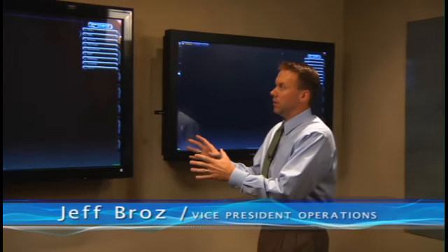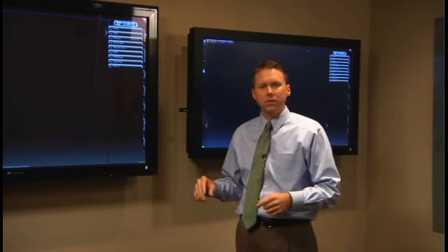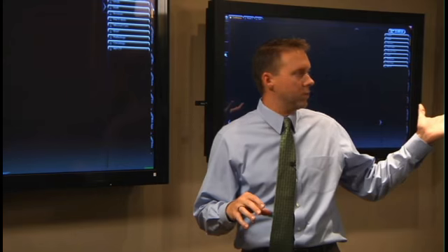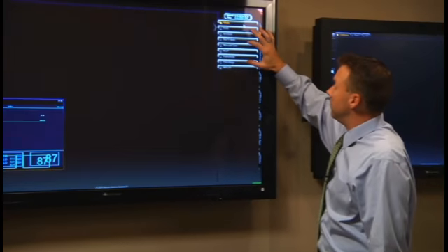I'm going to shift our focus over here to ControlOR and keep reverting back to this diagram to distinguish the differences between how a software solution like ControlOR and a hardware solution such as a typical video integration solution differ.